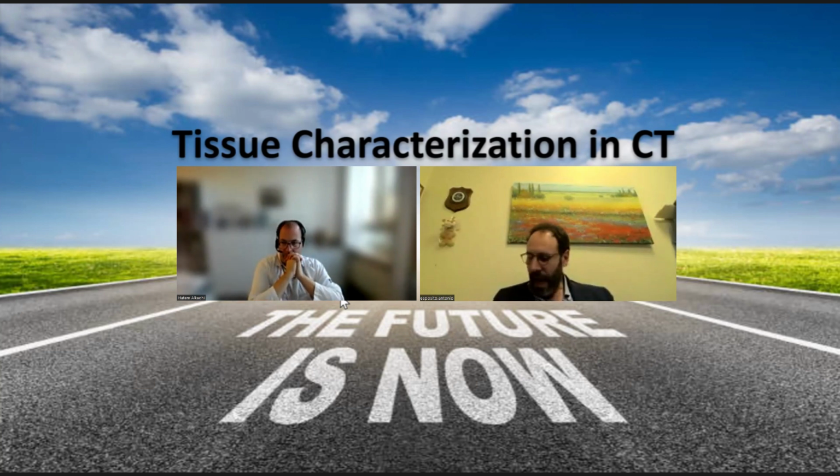Because absolutely it is a more difficult setting in the emergency department, particularly for the coronary arteries, because on the myocardial side, if the protocol is standardized and well implemented, the heart rate and the breathing of the patient have a lower impact than on the coronary arteries.